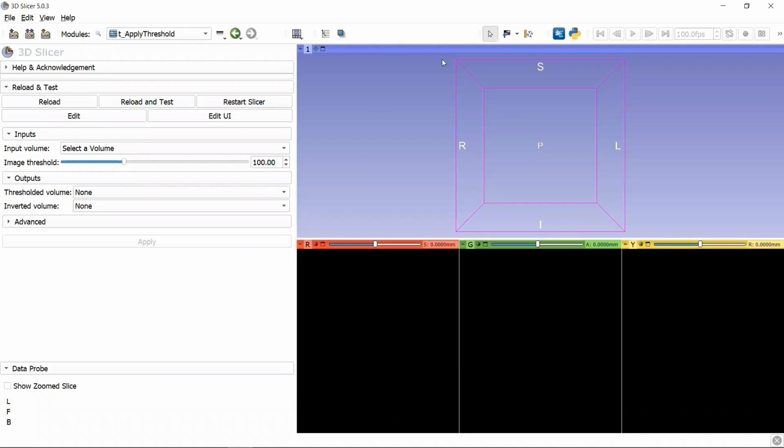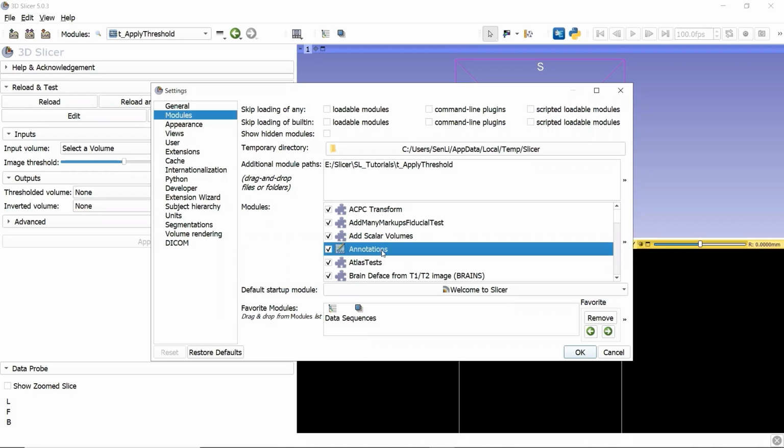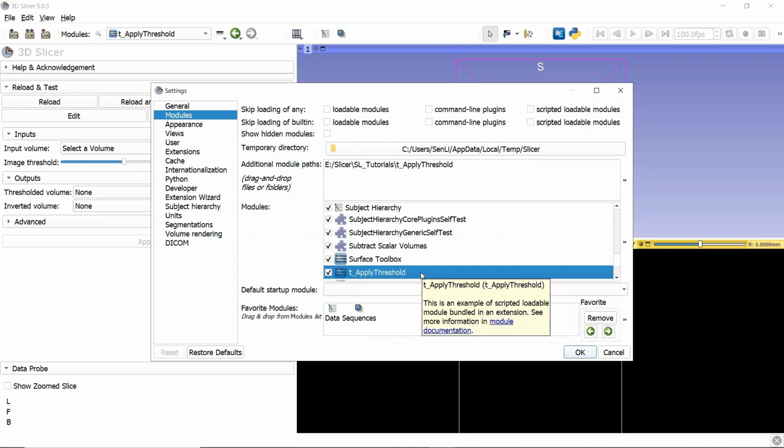Now let's add our module to the toolbar favorite modules. We go to the menu Edit. Click Application Settings. Go to Modules, and our module t-apply-threshold is already added to the additional module path. What we want to do is to find our module t-apply-threshold from this module list, and then drag and drop to the favorite module. So we click the one and press the button t to drop. This is our module t-apply-threshold. We drag this module to the favorite modules. Here we go.